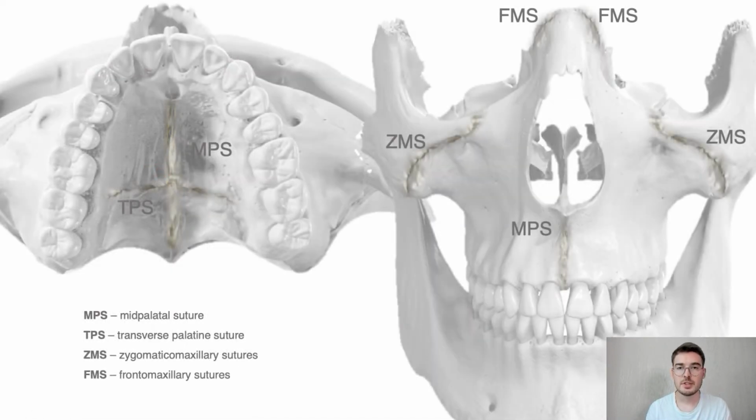The anatomy of the upper jaw is extremely diverse. The upper jaw has many joints with other bones, but we will discuss just the main sutures. So we are planning a skeletal expansion using Marpe. Such expansion is almost always V-shaped. Imagine that there will be a rupture here.